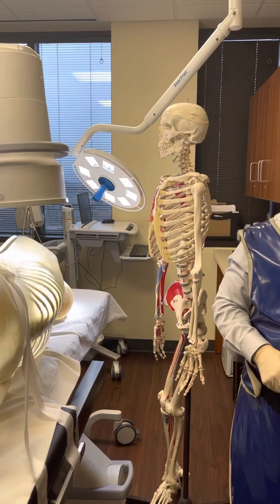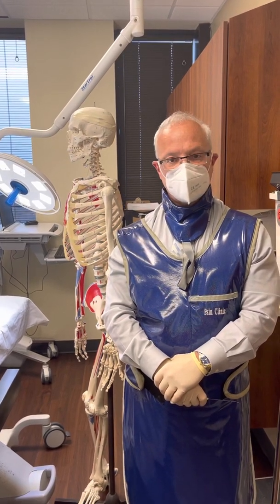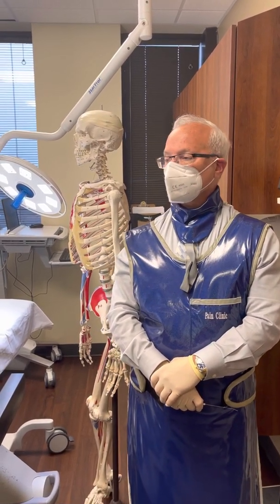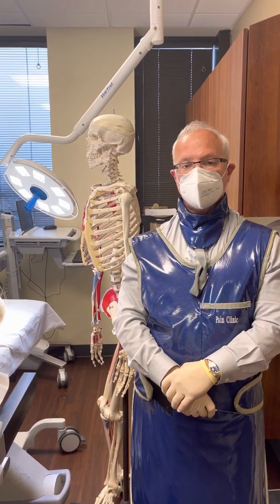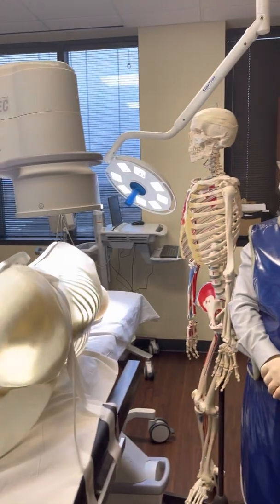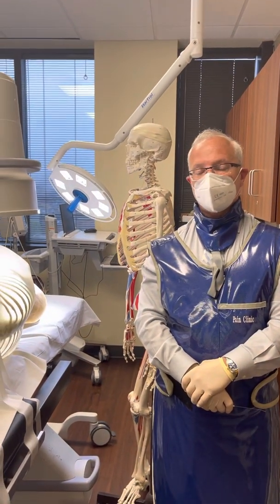This is a procedure in the head and neck where there's the possibility of trespassing to the vertebral artery, so for every patient there must be a free-flowing intravenous line in place. Sedation is not obligatory, and in my own practice I do not employ sedation for this purpose. It's critically important that the patient remain immobile. The technique may be performed with the patient in the supine position, prone for the posterior approach, or the lateral approach. For this demonstration with my cadaver specimen, I will have the specimen in the lateral decubitus position, and bolsters are used to support the body and prevent movement.